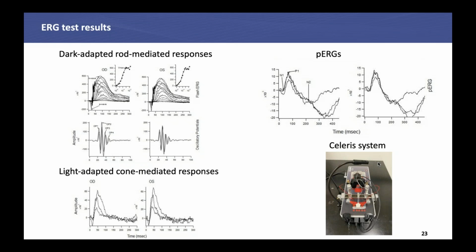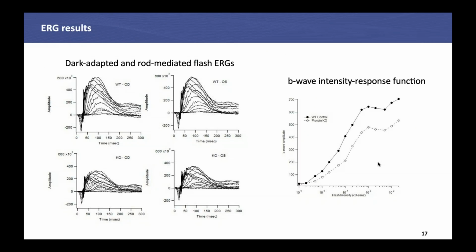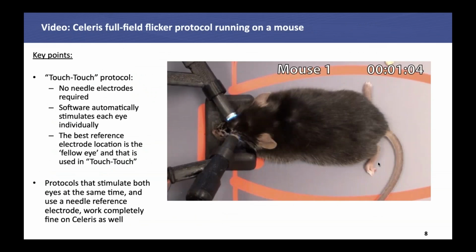Then it will flash the right eye, wait 5 seconds, flash the left eye, wait 5 seconds, and then flash the right eye again. So you wind up waiting the full 10 seconds between stimuli for any given eye, but you'll still have interleaved one flash from the other eye during that time. So it doesn't actually double the amount of time taken. It just adds 1/2 of your interstimulus interval.